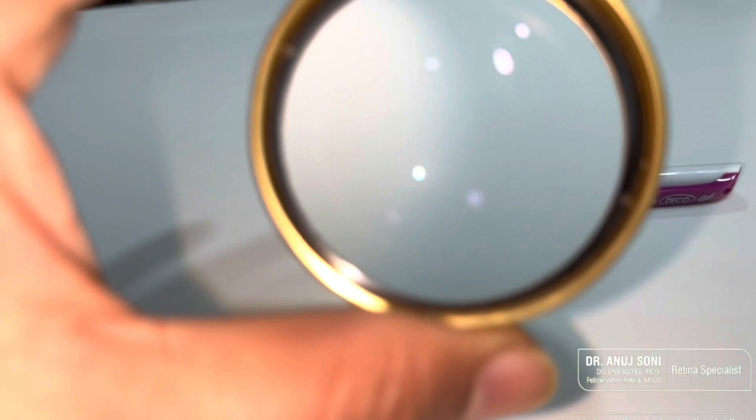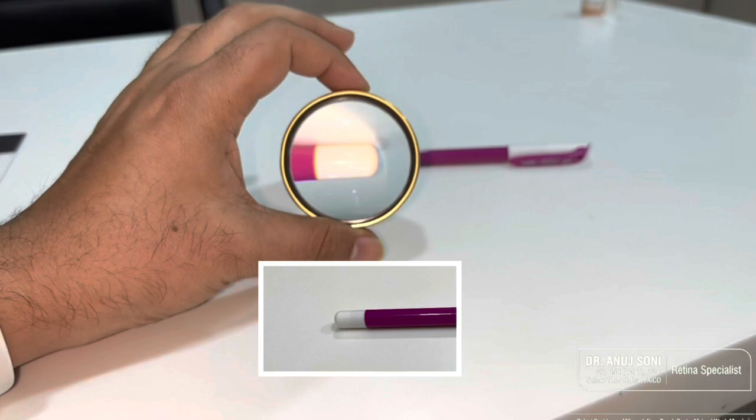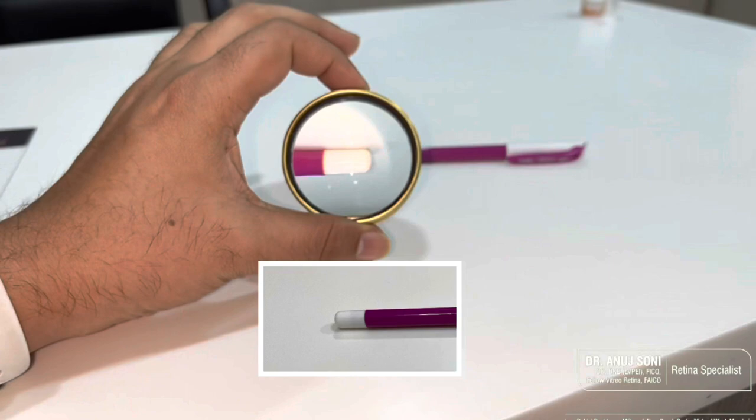Now when I examine the bottom end of the pen, I will see the bottom only. I will not see the cap. Only thing, its orientation would be changed. So you can compare with the original image and now you would understand what it means by an inverted image.